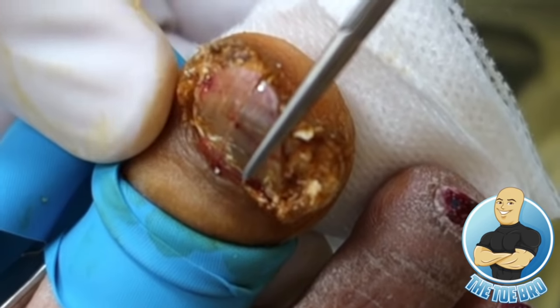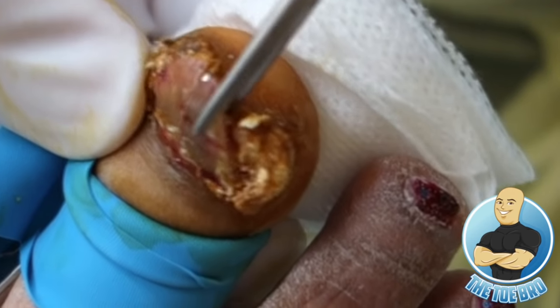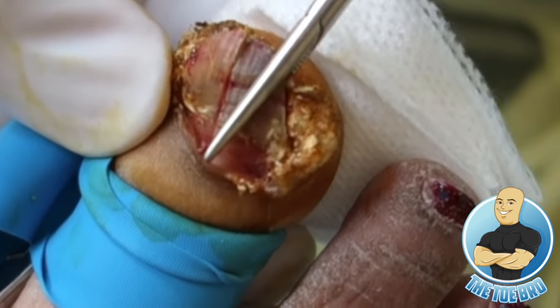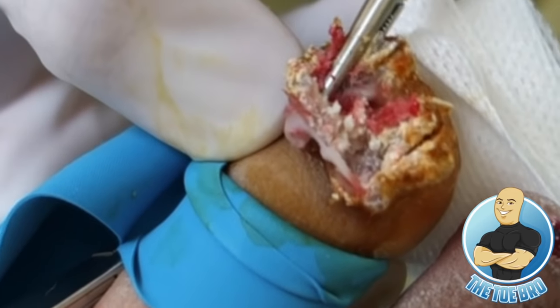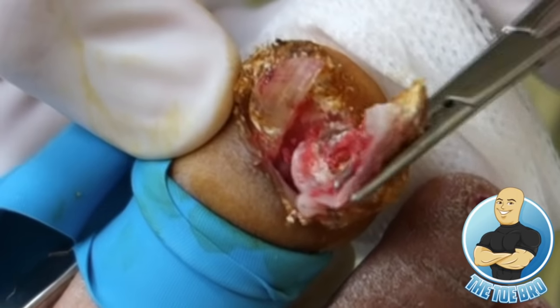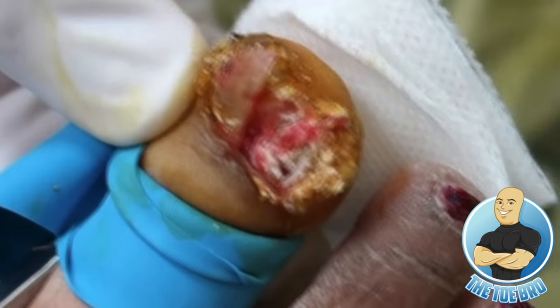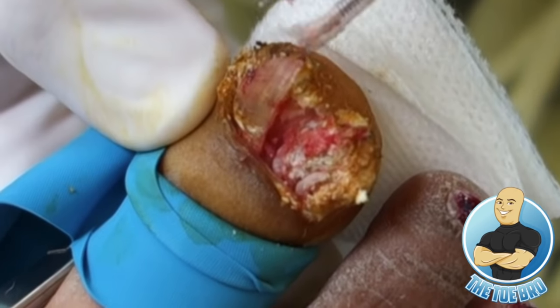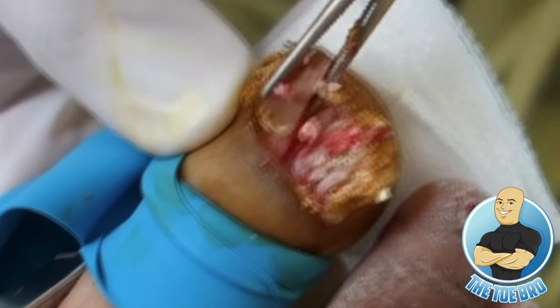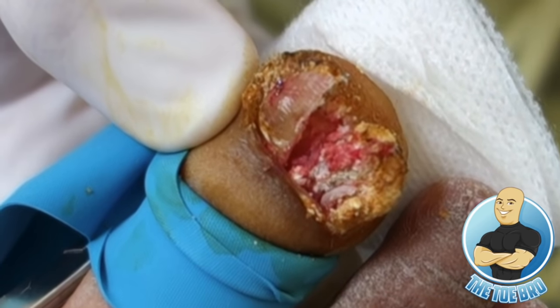So one little note, as you can notice in this video, I'm a little bit more quiet with the patient. That's because I was really focused with this case. It was really unbelievable to see how much dead tissue, fungal debris, and warty tissue was hiding underneath this nail. So after removing half of the nail, I'm going to use my hemostat to try to remove as much as I can before having to do further trimming or cutting of that soft tissue.